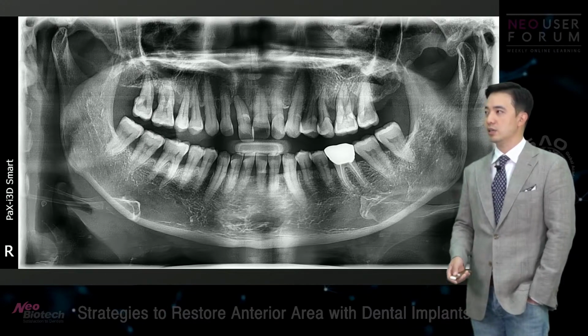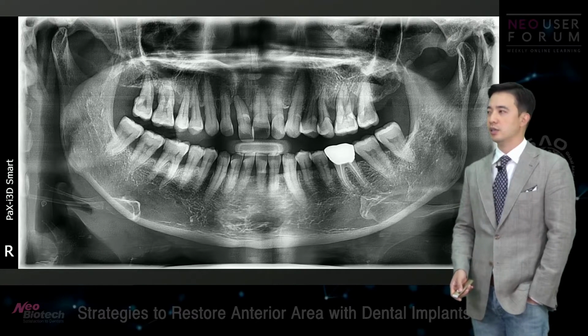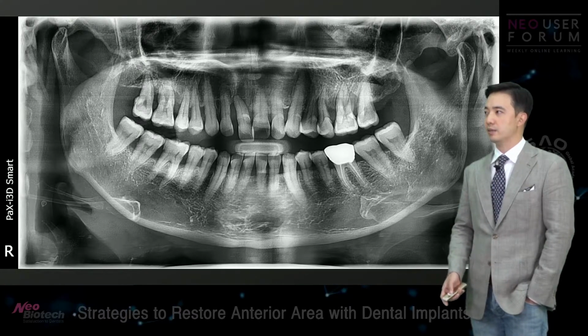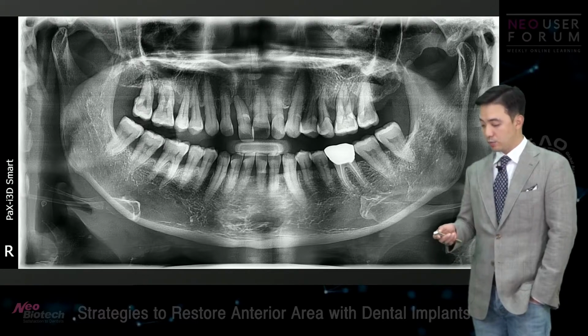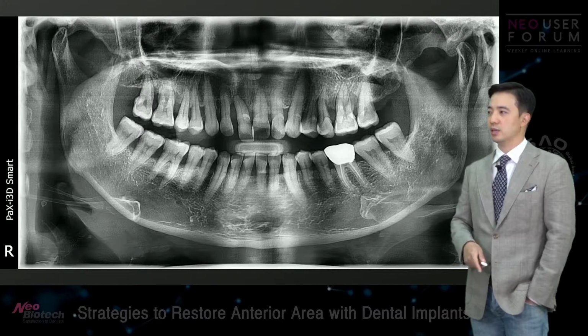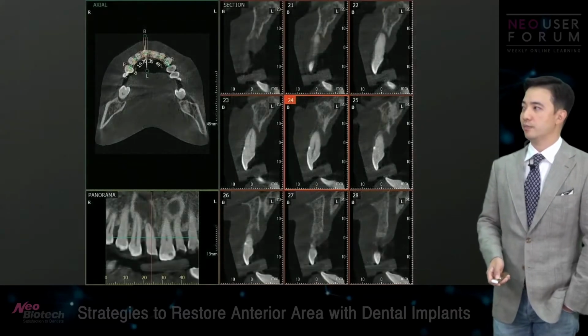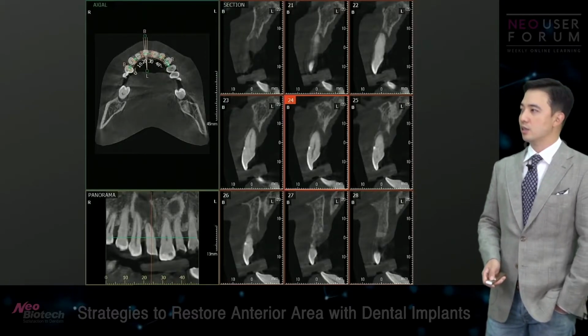up having a really, really long clinical crown with the recession. So it's going to look bad for sure. So I just didn't want that. And after having those kinds of experiences with massive GBRs and all that, I just wanted to avoid those kinds of situations. Well, look at this.